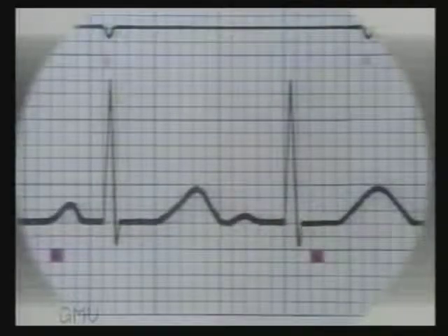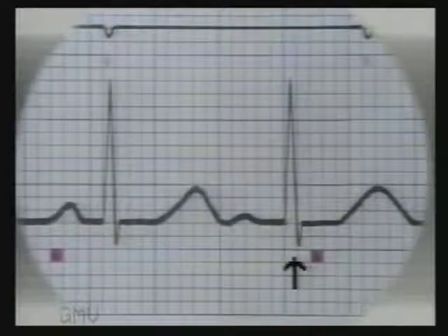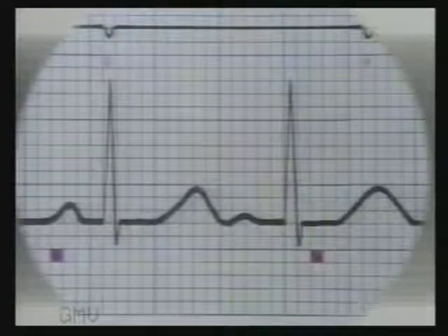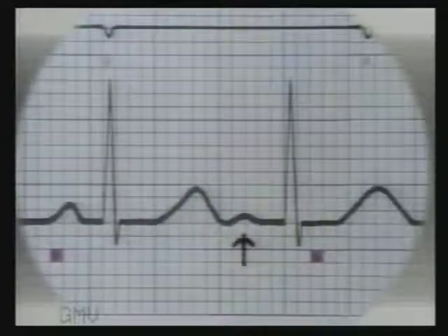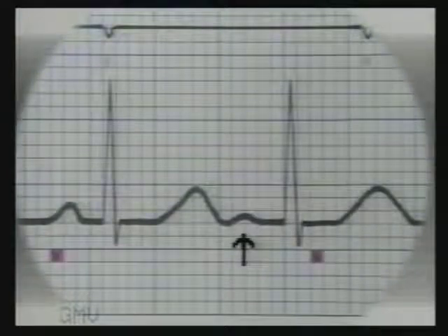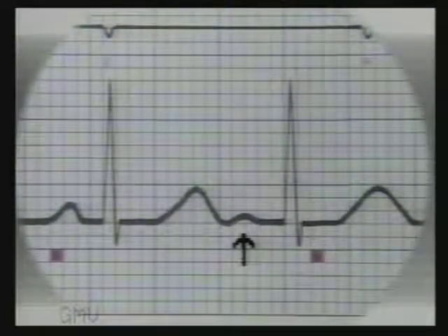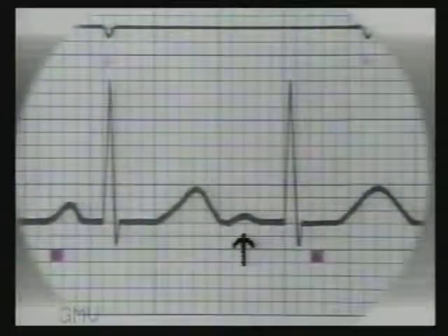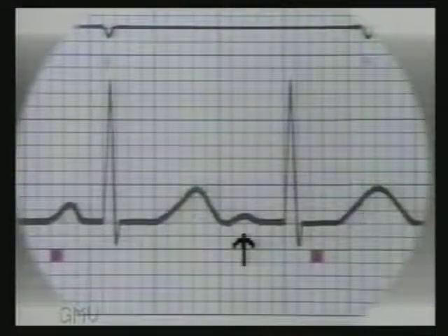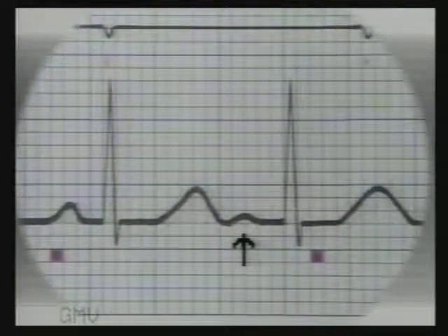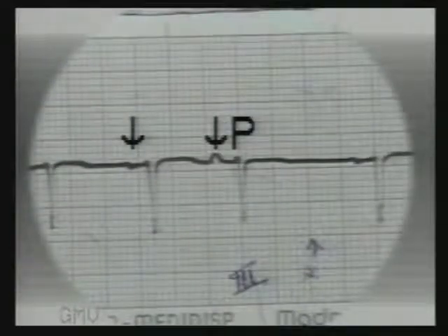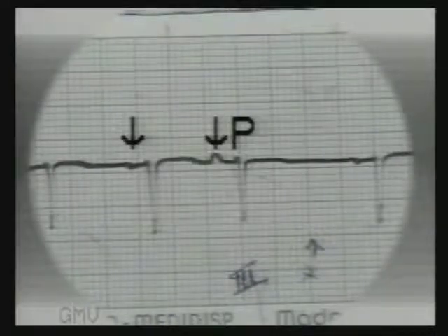When the QRS complex of the premature beat has normal configuration, the beat is supraventricular. Its site of origin can be determined by studying the P-wave. In this premature beat, the P-wave is similar but slightly different from the other sinus beats — this is an atrial premature beat. Note the upright P-wave, slightly altered, in an atrial premature beat, with a normal PR interval. In this ECG, the premature beat shows an altered P-wave different from the regular sinus P-waves, so this is an atrial premature beat.